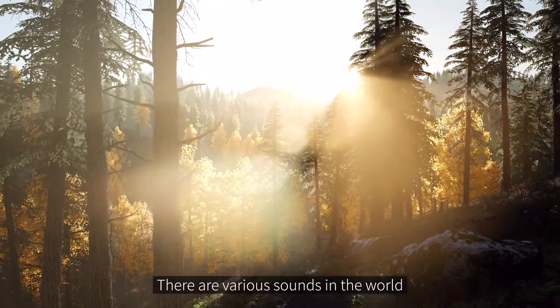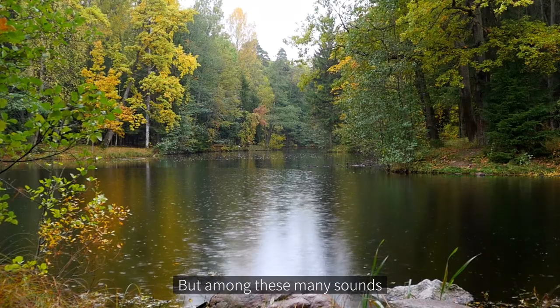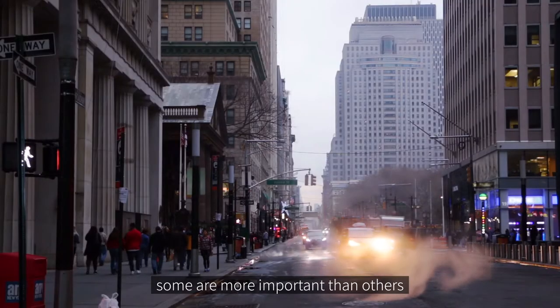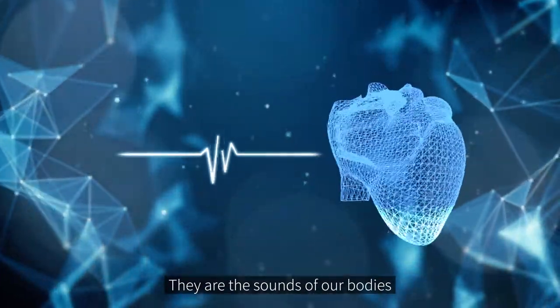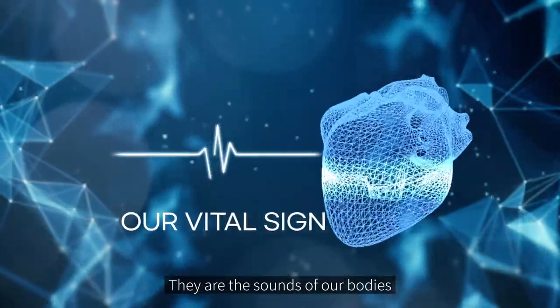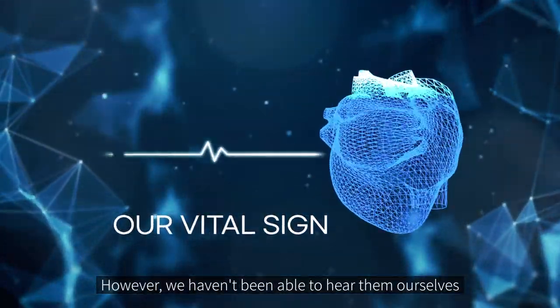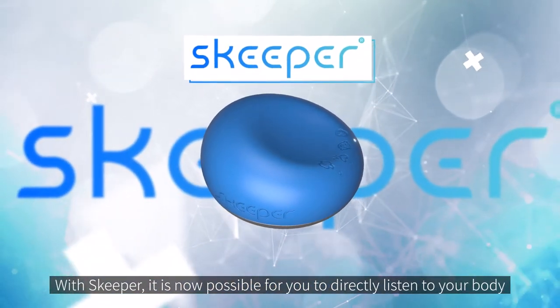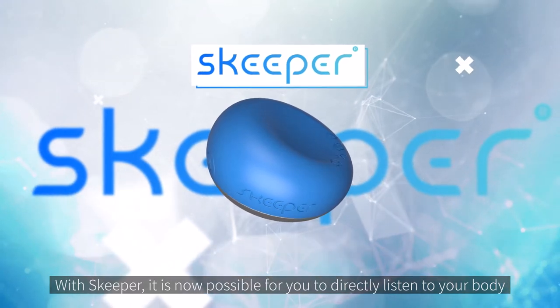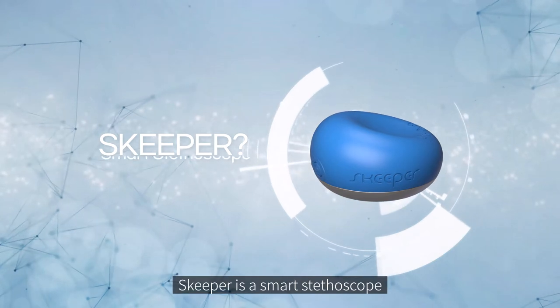There are various sounds in the world, but among these many sounds, some are more important than others — they are the sounds of our bodies, our vital signs. However, we haven't been able to hear them ourselves. That is, until now. With Skeeper, it is now possible for you to directly listen to your body.